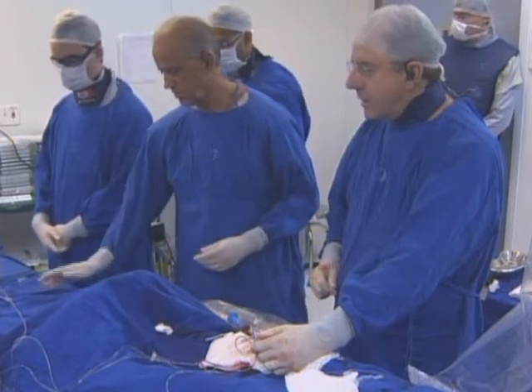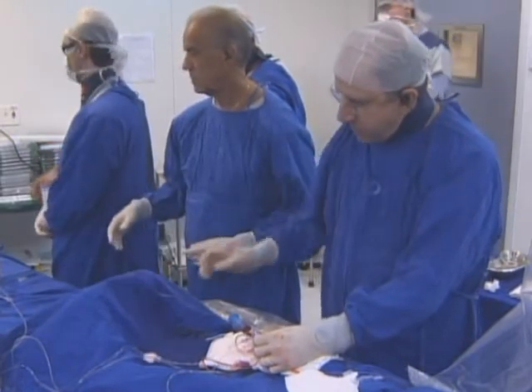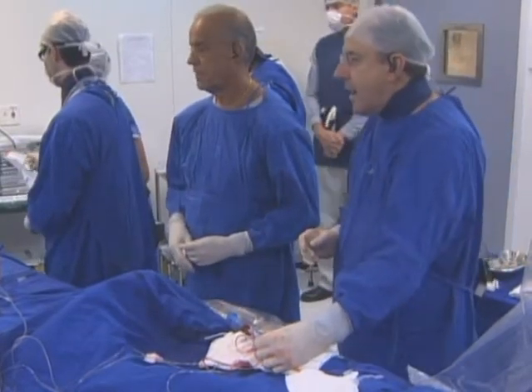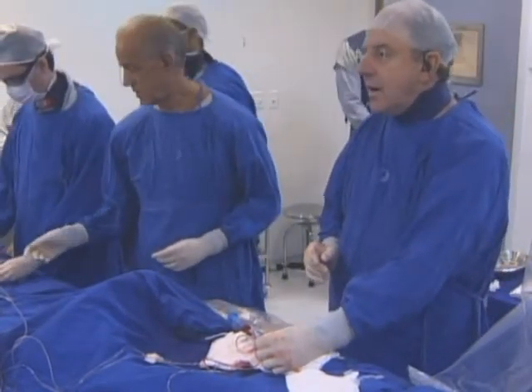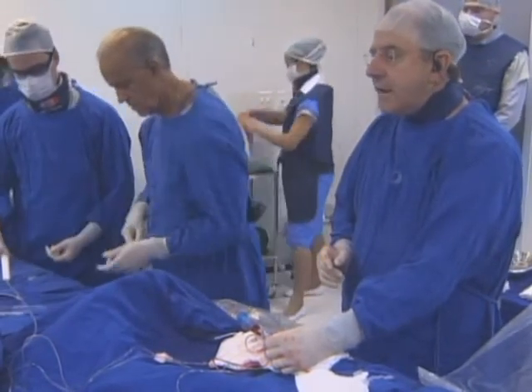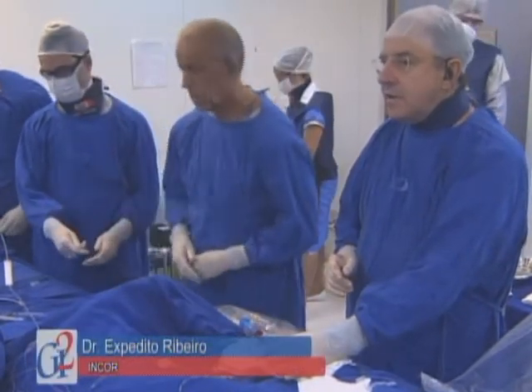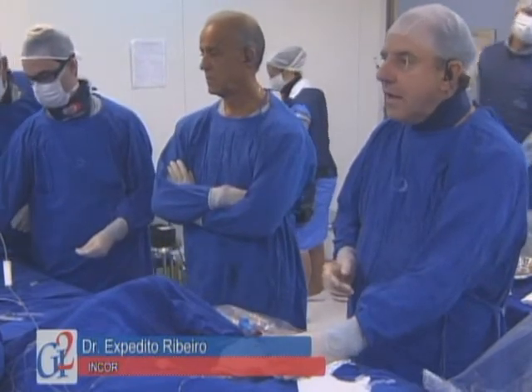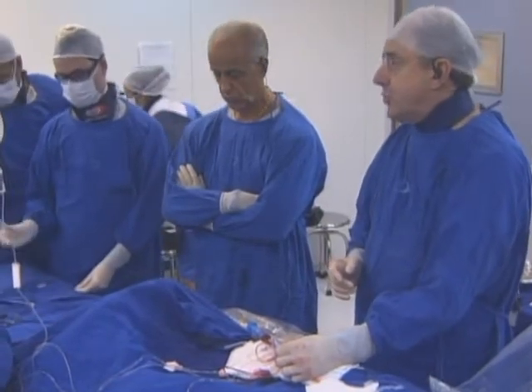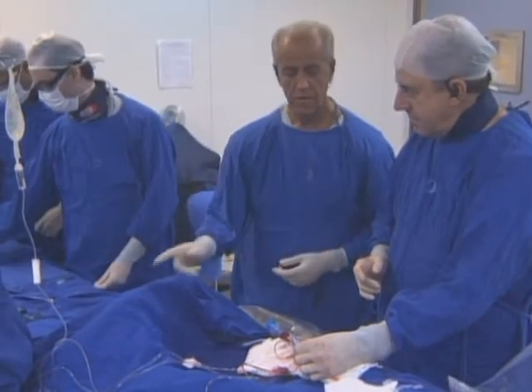With your wire, before we go to the technique, what kind of support guiding catheter and size do you use? Yeah, Alex, this is an important question. I think it is a case like that. We are thinking about a double stent technique. I use the 7 French, and my first choice for left coronary artery PCI is EBU or VODA. Now we are using EBU 3.5, 7 French.